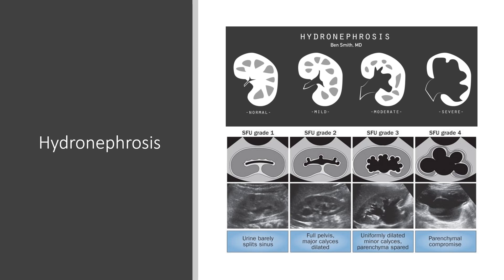In mild hydronephrosis, you can see blunting of the calyceal fornices and large calyces, but easily identified papillae. In moderate hydronephrosis, you see obliteration of the papillae with rounding of the calyces. In severe hydronephrosis, you can see extreme calyceal ballooning and thinning of the renal cortex.